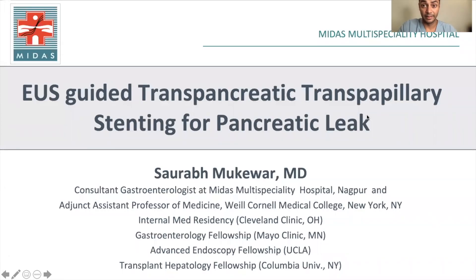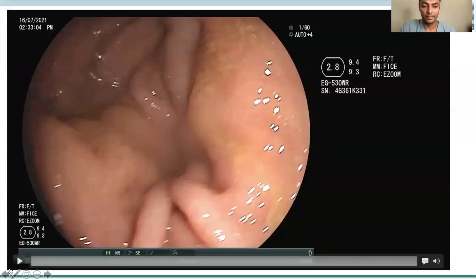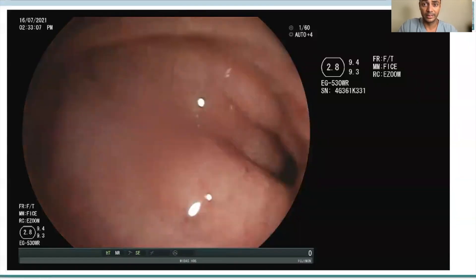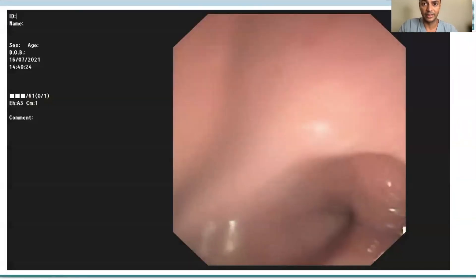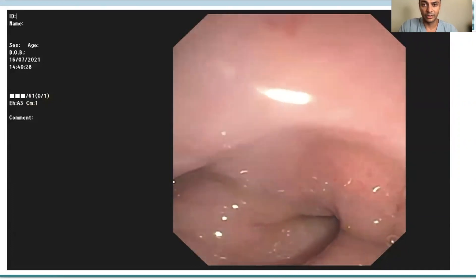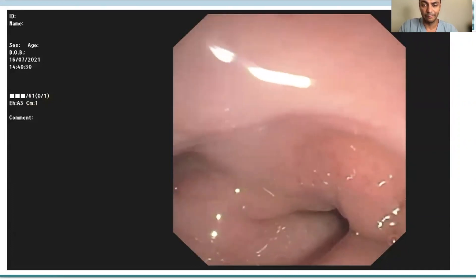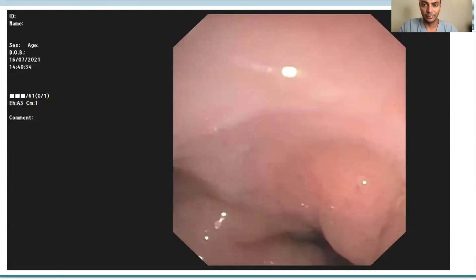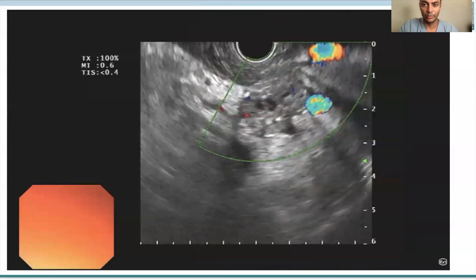This is a patient with a pancreatic leak in which ERCP was unsuccessful due to edema, and we ended up performing EUS-guided trans-pancreatic trans-papillary stenting. Here is the view of the endoscope advanced across the pylorus. There was significant edema in D1 and D2, and the side-viewing scope was advanced but could not be advanced into the second part of the duodenum, so we decided to switch to the EUS scope.